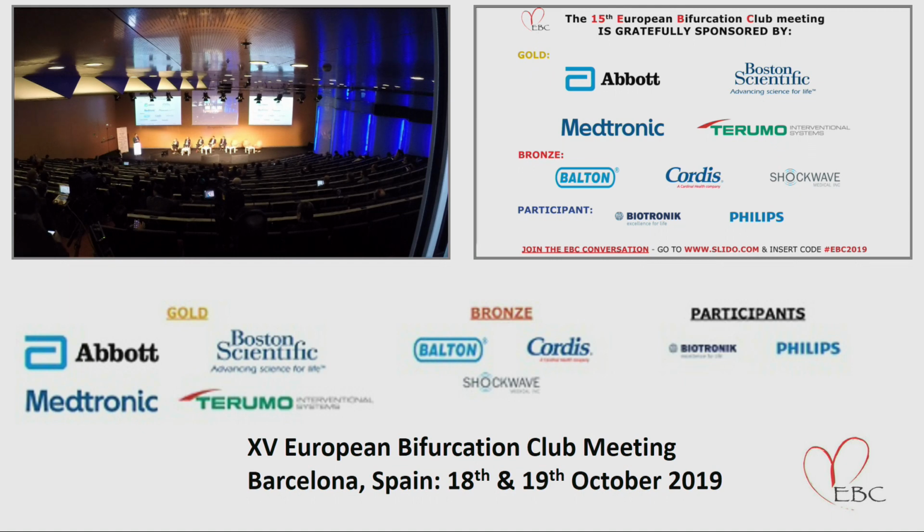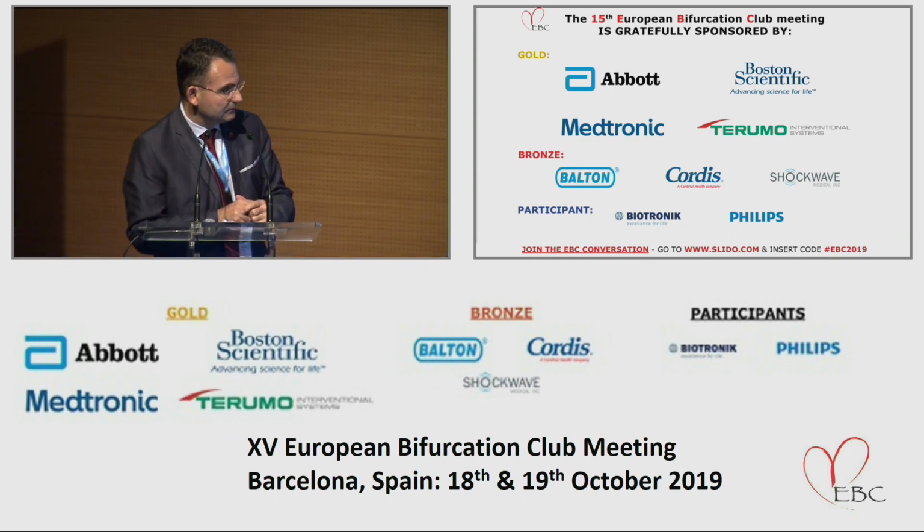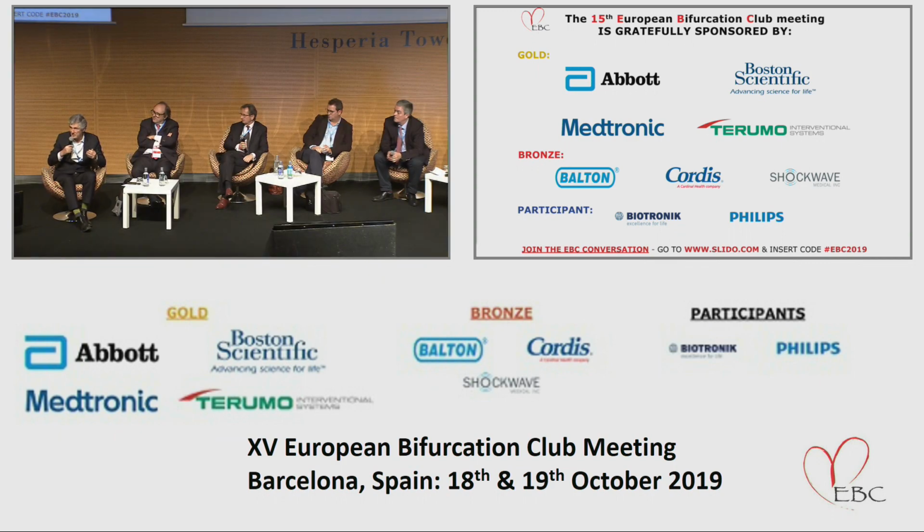We have seen that in the particular case that you showed, there was some residual lesion at the ostium of the LAD that could be improved by kissing balloon inflation, or at least a POT that we should do in this case. But the objective was to show what are the properties of this stent, which is really a strong stent dedicated to left main or ostial lesions from the right or other difficult lesions on big vessels.